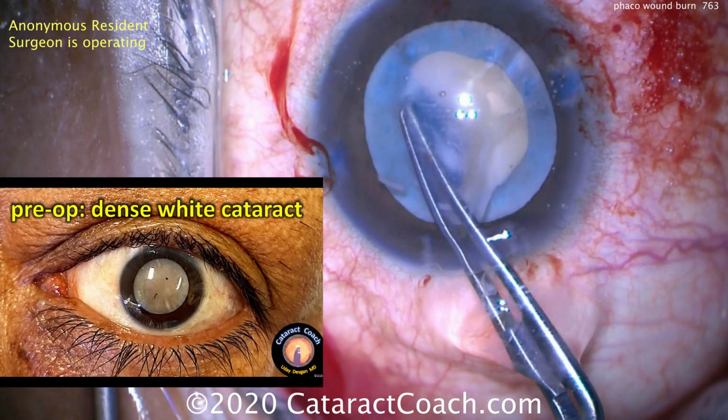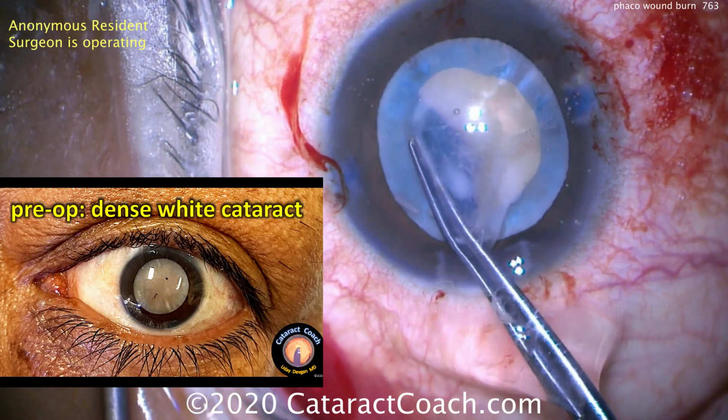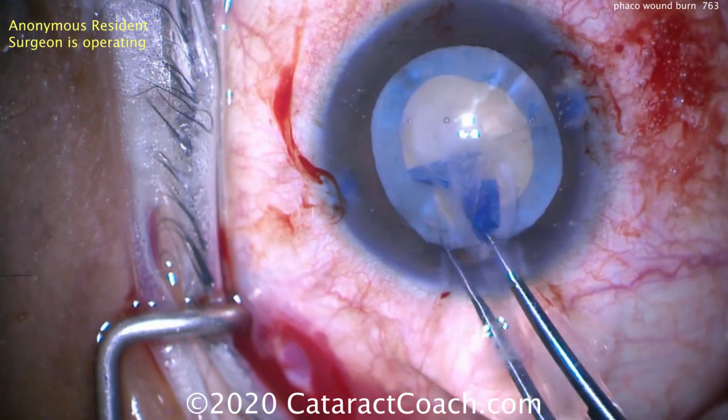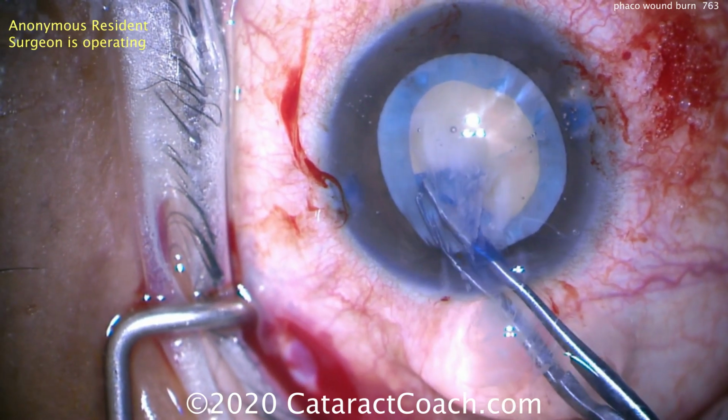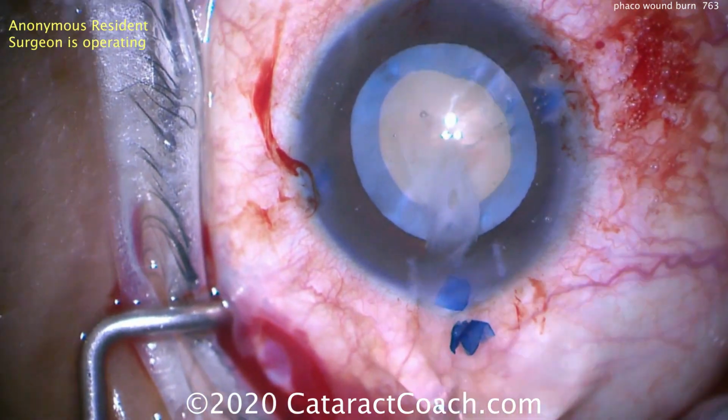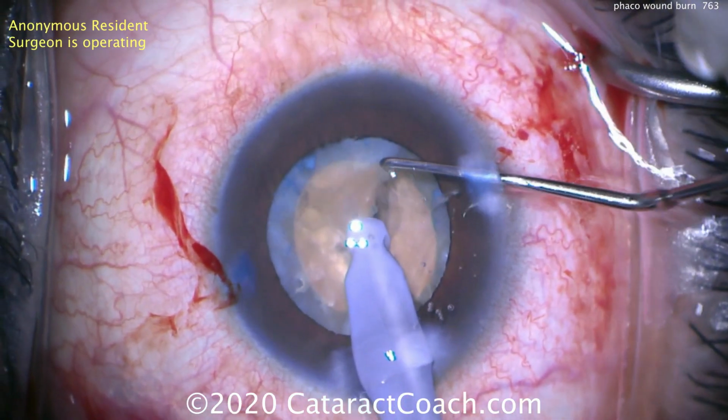Here's the pre-op. Patient had a really dense white cataract. The patient's getting a nice, beautiful capsulorhexis, so that's not going to be the issue. You can see the intumescent nature of this lens. We did the needle decompression and completed a very nice round capsulorhexis, a little small though.